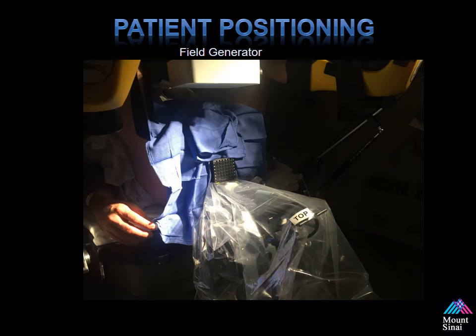Regarding positioning: once your setup is complete with the grid plate locked in place, you place your field generator above. This can be tipped slightly towards you to allow the EM field to encompass the stepper where the grid and the tracker is placed. If you go straight up and down and have interference from the table, just tilt it a little bit towards you — this can help with avoiding any EM interference during the procedure.